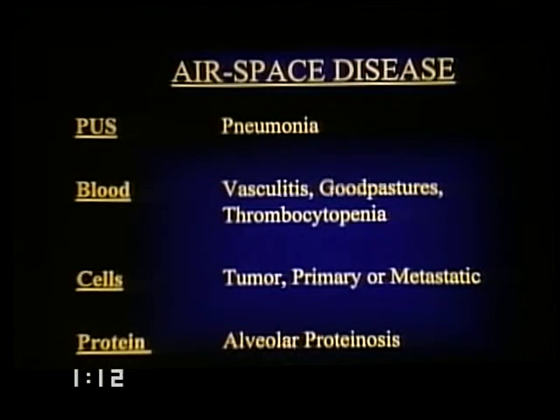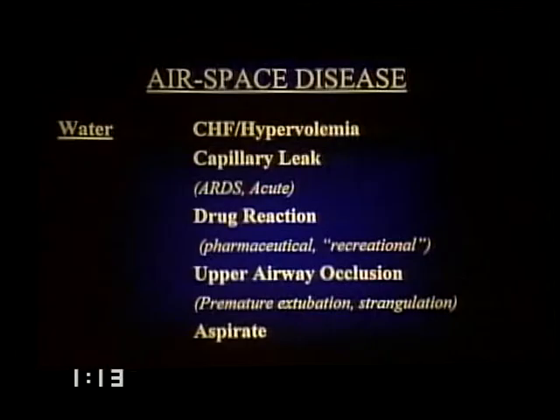Come back to the airspace disease: cardiomegaly, congestive heart failure, hypervolemia, very common. Capillary leak may be indistinguishable. They are both edema. Congestive heart failure and hypervolemia and capillary leak are both edema. It is just that capillary leak is a high protein edema and doesn't shift very much as one changes the patient's position. There are a huge variety of drug reactions that will produce both airspace and interstitial disease.